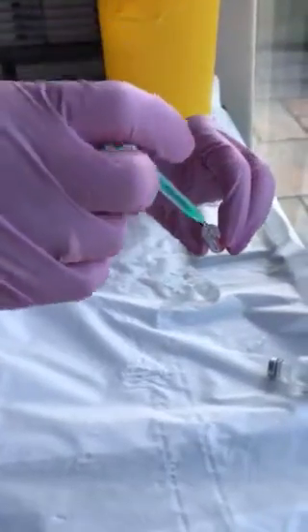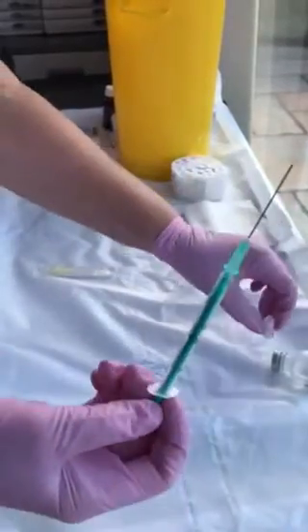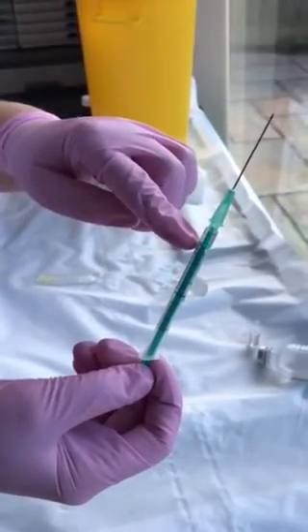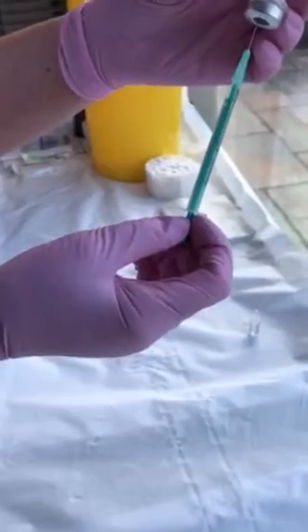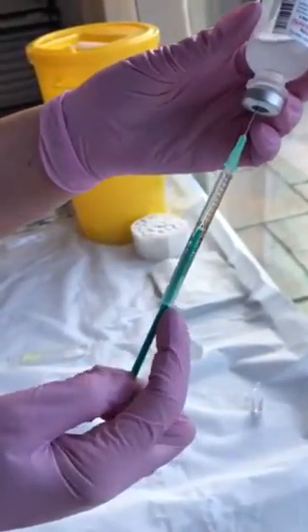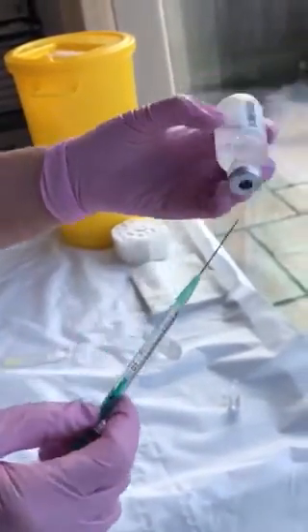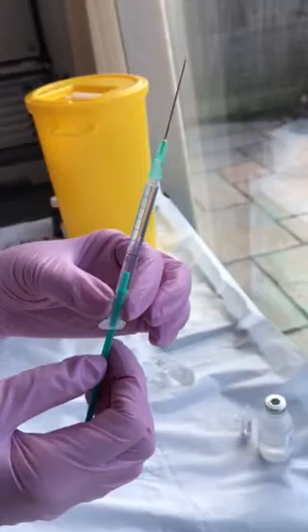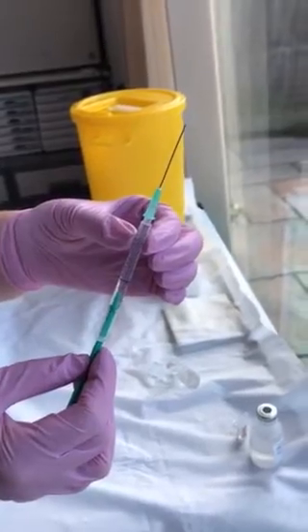I'm then going to take from there 0.1 of a mil. So there's 0.1 of a mil there, as you can see, of the diluted hyaluronidase solution. Okay, then I'm going to take the saline again and fill up 0.9 mils to make it up to a full mil. Okay, so that solution is your hyaluronidase made up with 1 mil of saline — so every 0.1 of a mil is 15 units of hyaluronidase.